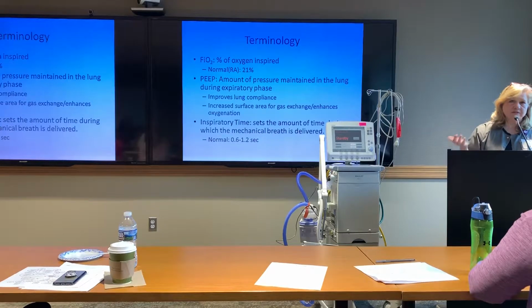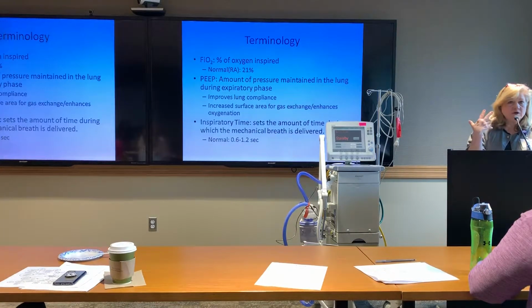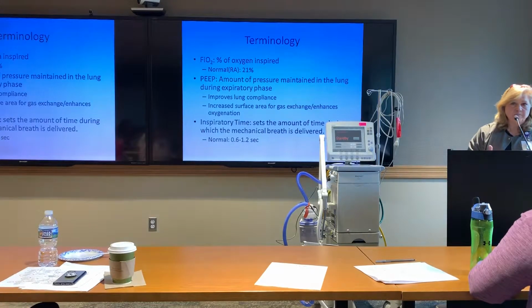I don't know if you guys have worked a lot in the ED or if you've ever taken care of somebody with CHF. Sometimes just putting them on a little high flow nasal cannula, which creates a little CPAP effect, is enough to help open up the lungs enough to improve their work of breathing so that they can breathe effectively. I don't need to put them on BiPAP or intubate them short term. So PEEP is a good thing. It generally will improve oxygenation, help decrease work of breathing, and help restore resting lung volume.